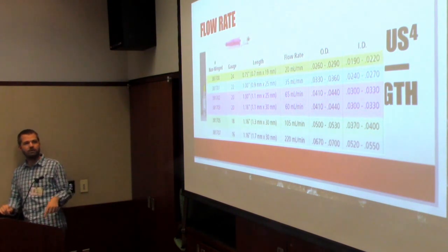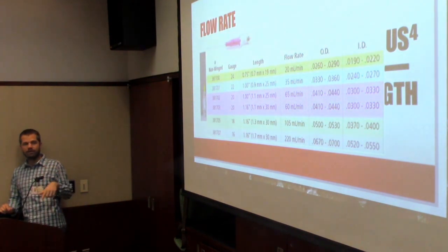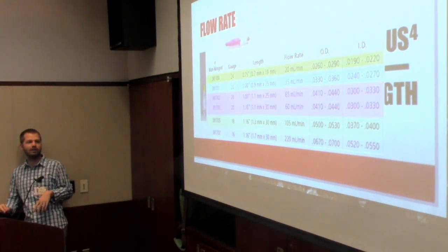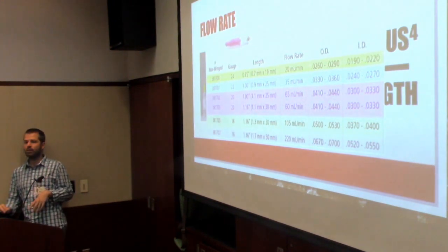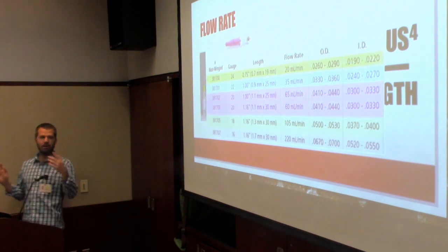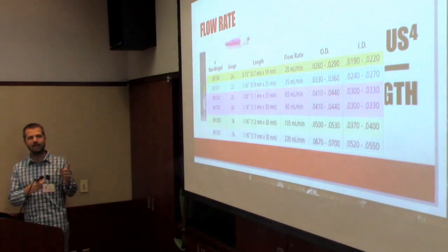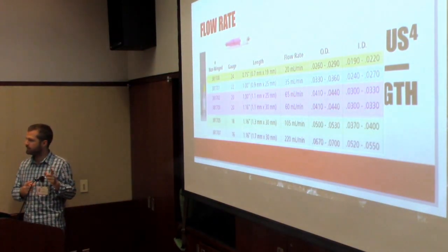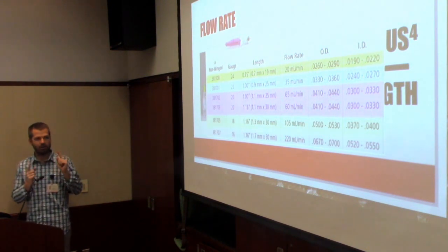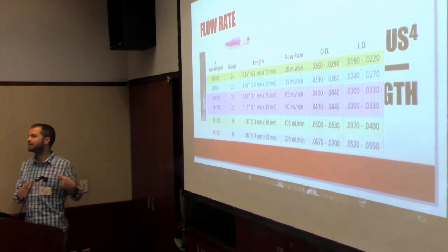It's also good to know this for relative comparison. The Cordis, the specific brand, does 300 milliliters per minute flow rate. If I don't know where the sheath introducers are, but I know where a 16 gauge and an 18 gauge are, I'd rather just put those two in and get the exact same max flow rate. It's great to stick a giant tube in someone's leg, it's very satisfying, but there are equivalents out there, and if your goal is to do a certain amount, it's good to know what the comparables are.